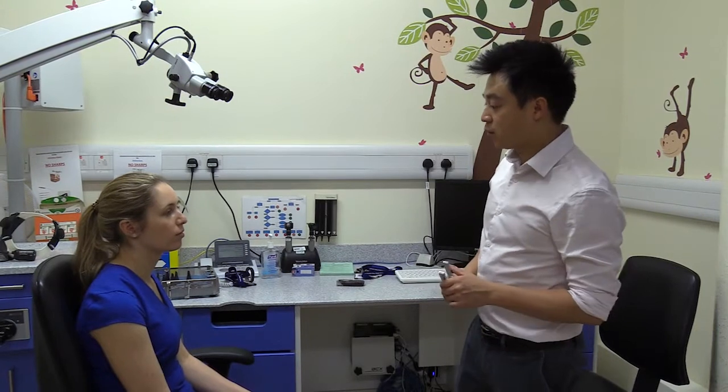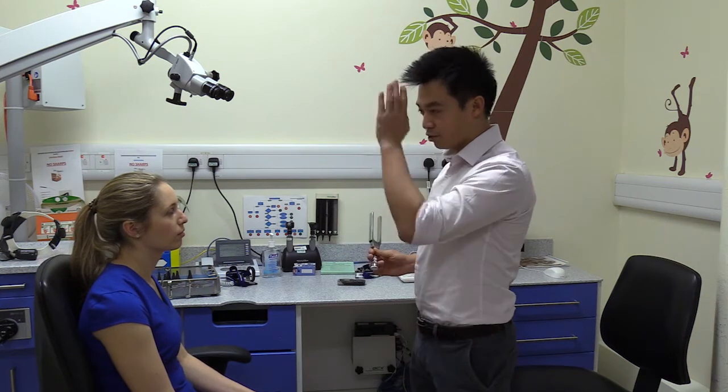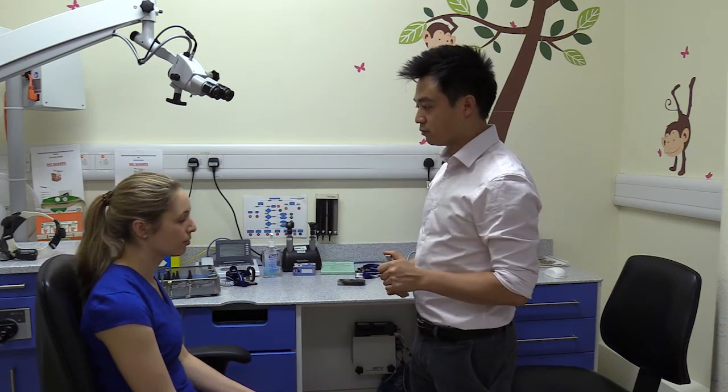For this next test, I'm going to place the tuning fork right in the centre of your forehead. I'd like you to tell me: is the sound louder on your left or your right ear, or do you feel the sound is right in the middle?